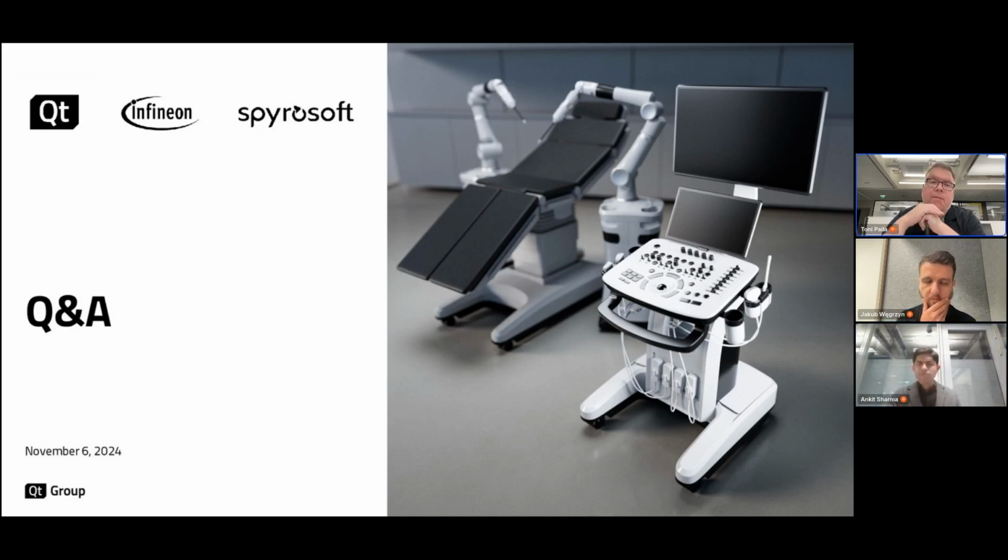Okay. Then there was a talk about testing, and there is a question: are there any solutions that allow testing of these medical graphical user interfaces on real production hardware? I think it's for Jakub. Yep. As I mentioned in my presentation, we would use Squish for that. Of course, depending on the target hardware you use, some adaptation would be required to make sure that Squish can communicate with and execute those automated tests on your hardware.